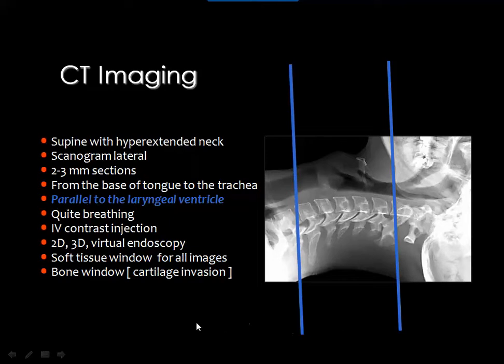Then we do not usually ask the patient to hold the breath or to stop swallowing, and these two instructions will make the patient more anxious to swallow and more anxious to have deep breath. Then don't give the patient any instructions about breathing or swallowing.